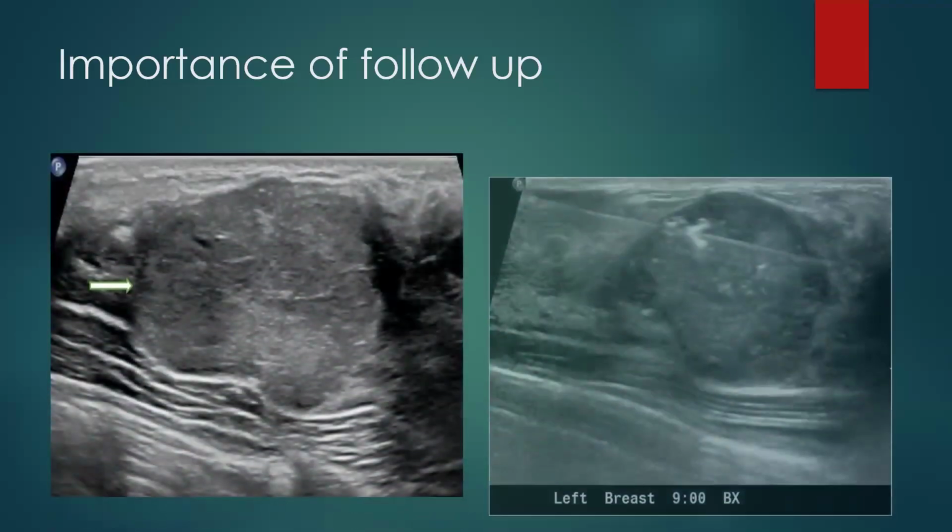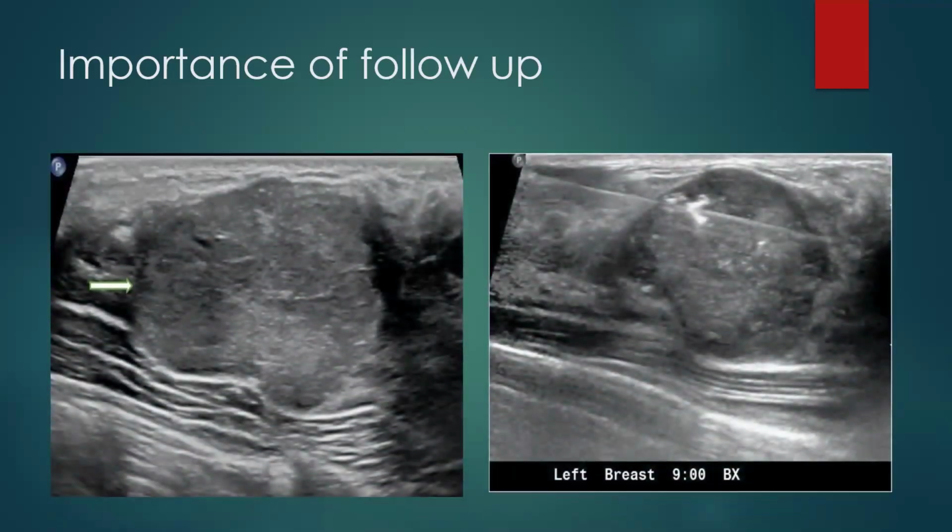These are images to show the importance of follow-up in the case of fibroadenoma. This was a benign fibroadenoma until recently, when it started to develop some ductal carcinoma in situ at the margins of the fibroadenoma. So you always need to follow up your patient.